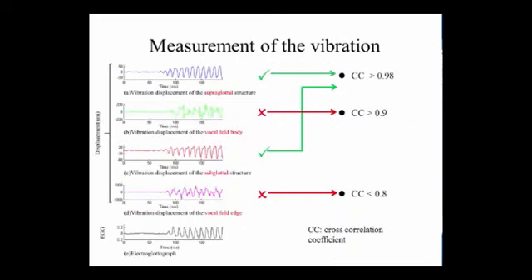So here are the waveforms we got, and as you can see from the vibration waveforms of the supraglottal structures and the subglottal structures, we can see that there is an obvious transition from the static state to steady and periodic vibration, because the subjects were asked to start voicing from quiet breathing.